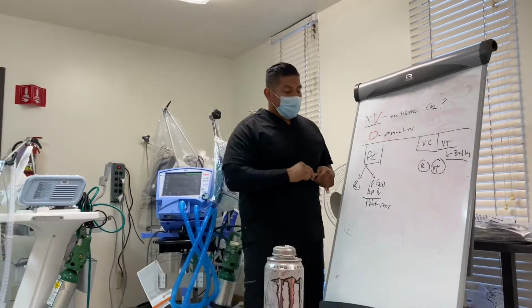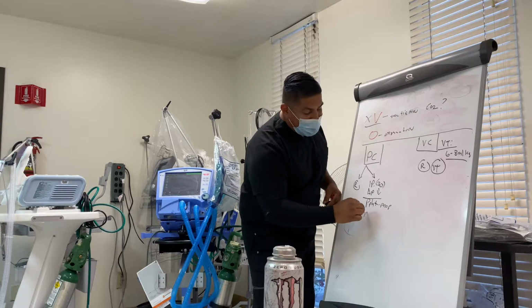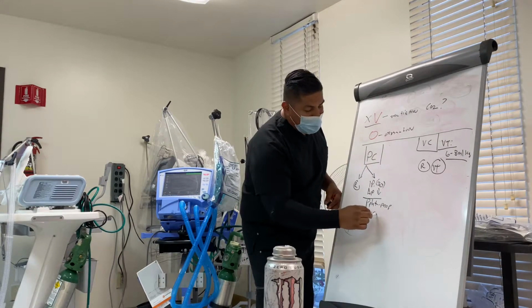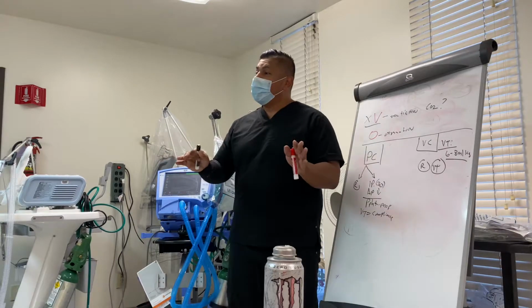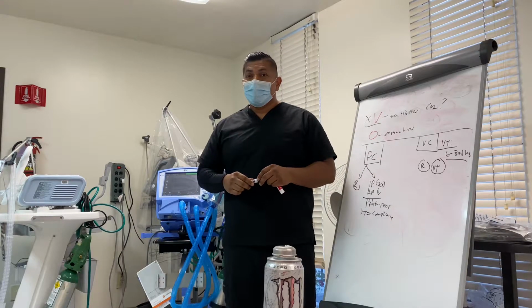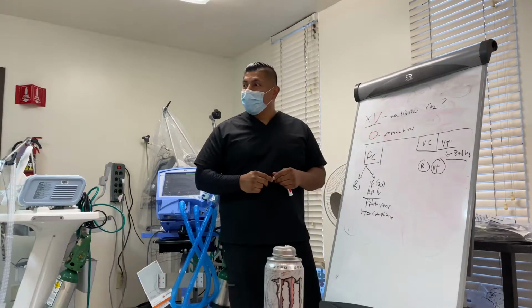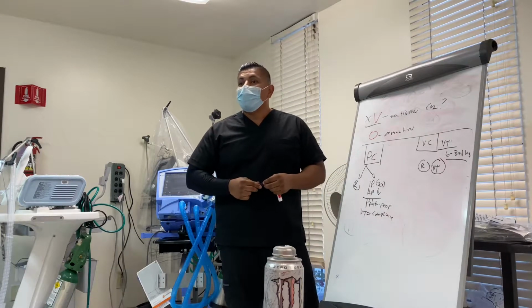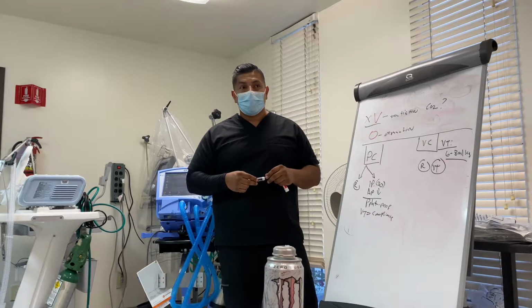Now, tidal volume on inspiratory pressure is directly related to lung compliance. If my lung compliance is crap, the volume I'm going to get is crap. So you might have to adjust your inspiratory pressure to improve your tidal volume. Does that make sense? Yeah.